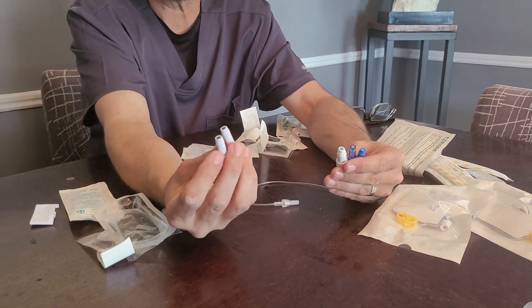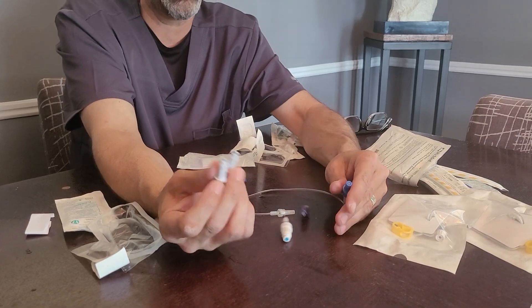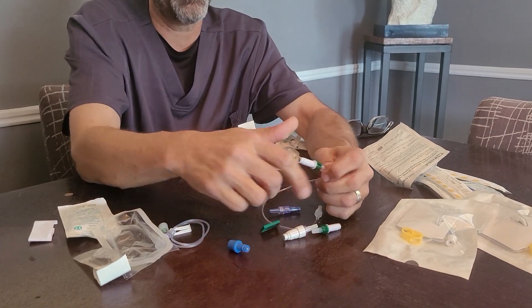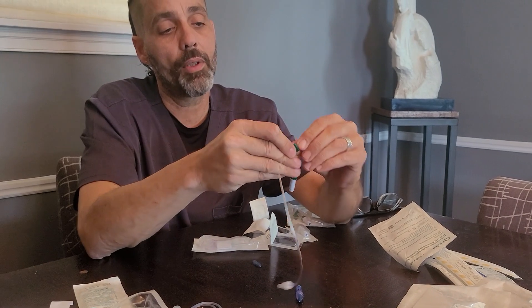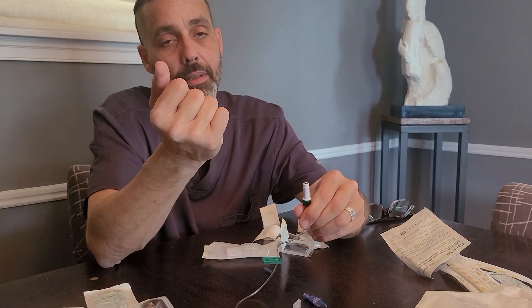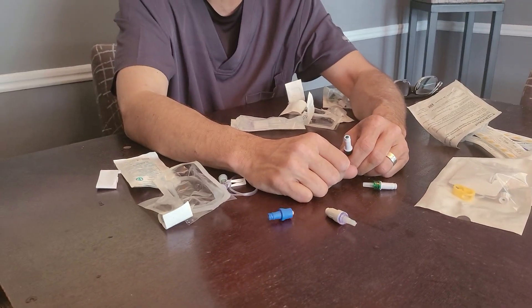These would be the only times that you'd have your patient clamp the line. If they do have the negative pressure injection caps or hubs on the end of the line, you want to have them clamp the line prior to removing the heparin at the end of the infusion — that's when they should clamp it. This is really for any patients out there who were confused, or any nurses who might be learning.